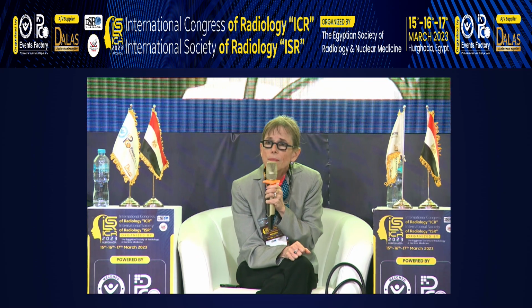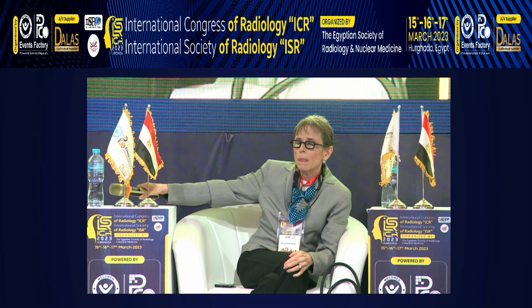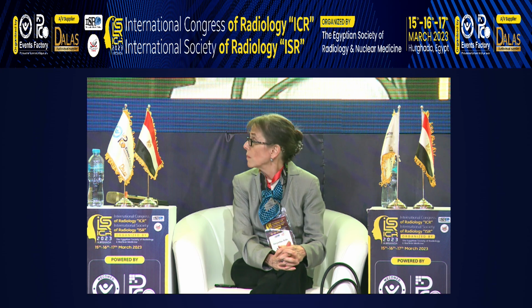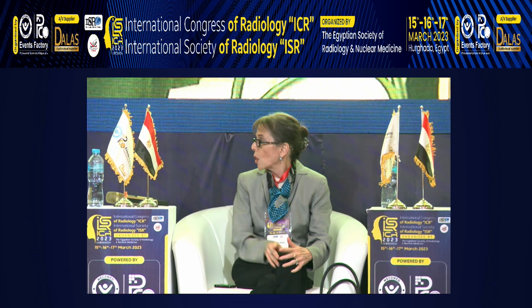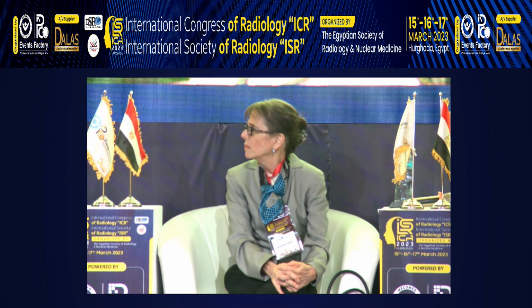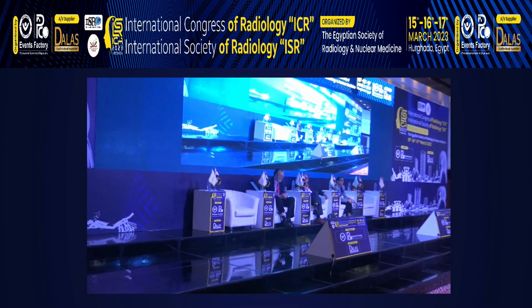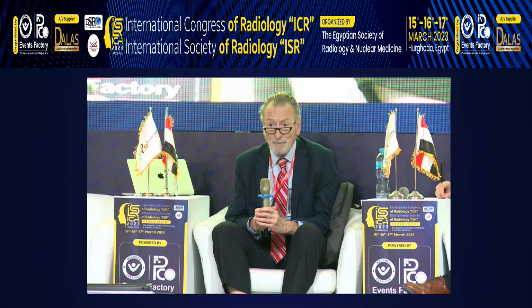Okay, thank you. The other question is for Professor Renato. How about Modic type 1 for differentiation of spondylodiscitis? Actually, it may be also high on STIR, it can enhance for Modic type 1 end-plate degenerative. Yes. Well, if you consider Modic type 1 is a kind of infection, there are several experiments showing that there may be slow infection. So it's really impossible to know that.